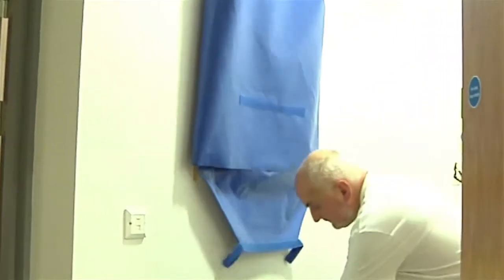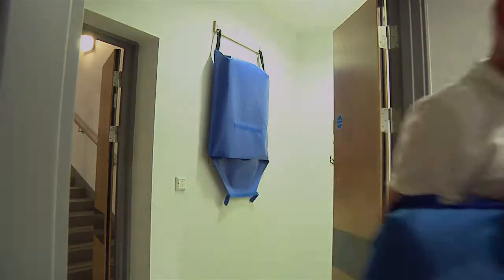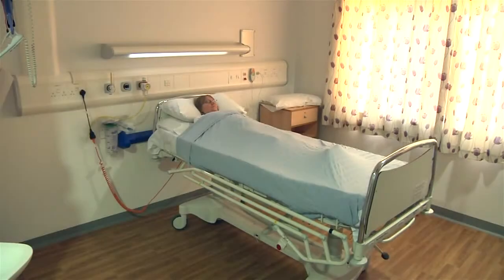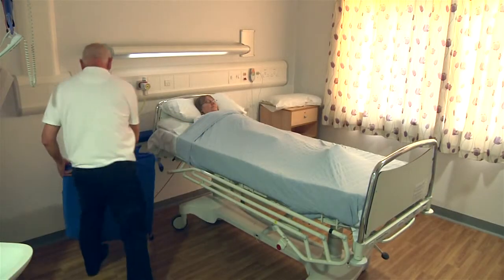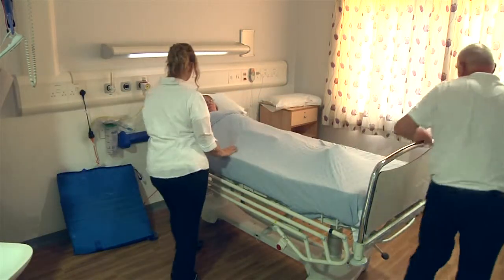When required in an emergency, release the Velcro strap on the outside of the vinyl case and the ski sled will automatically slide out ready for use. The ski sled can then be carried to the area where evacuation is required.